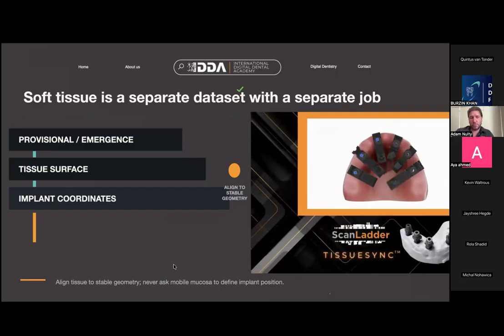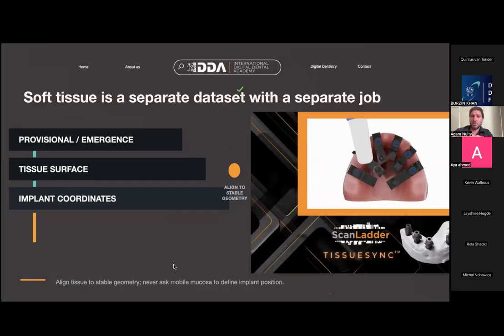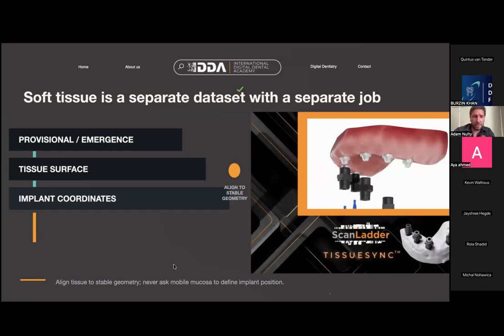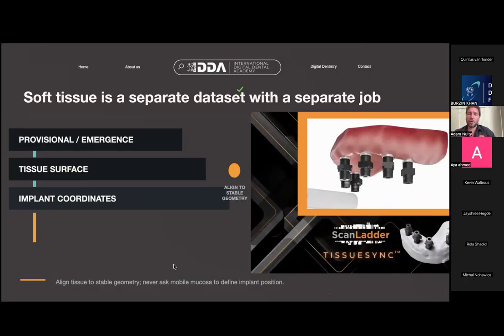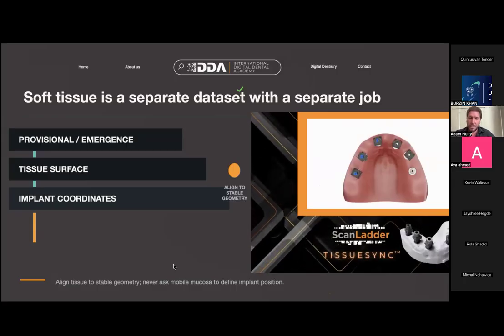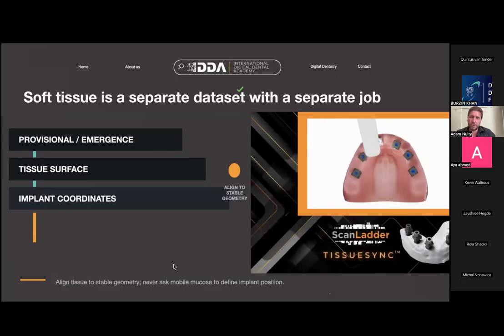And I would add to that as well, going back to what we said before, it's incredibly important to have that soft tissue aligned with the pre-op data set well, and also aligned with the face where we've generated and used all those principles Quintus talked about. If we align all of the data sets accurately, then we can maintain what we talked about right at the beginning, the midline, the smile line. We can plan ahead and look at where the end result is going to be.